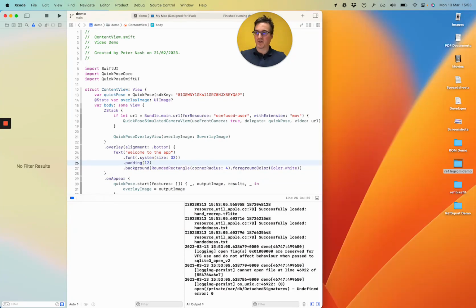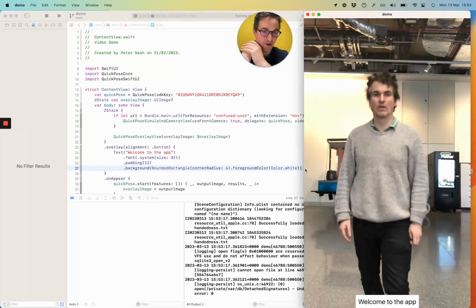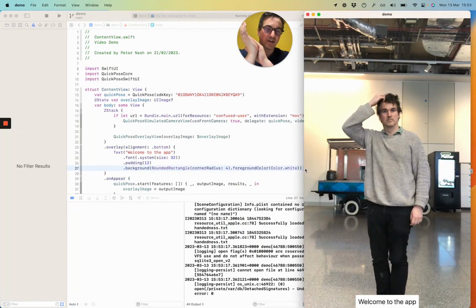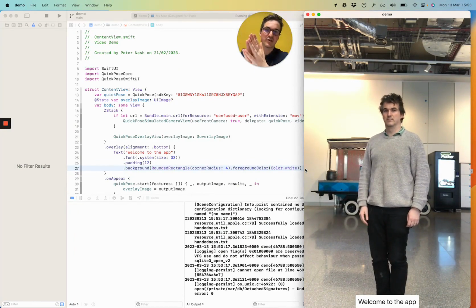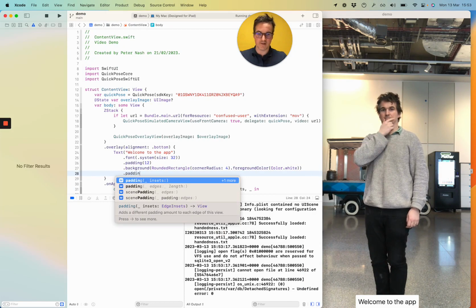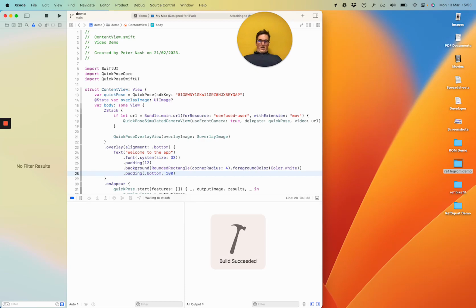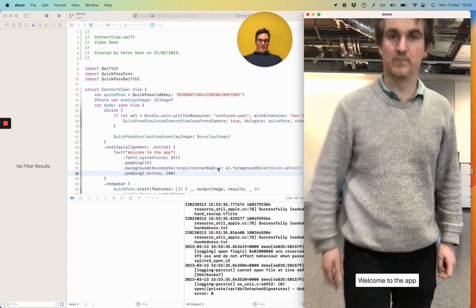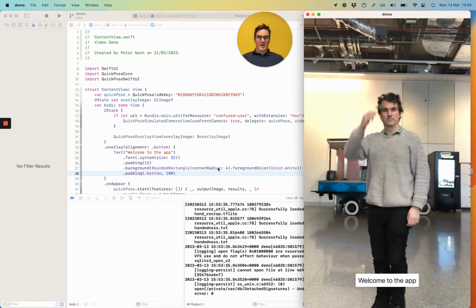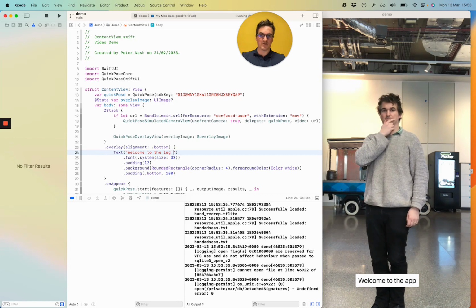I'm wary of this becoming a sort of a very detailed SwiftUI tutorial, but we need to find a bit of a balance between demonstrating the SDK features and exploring SwiftUI. So okay, I'm going to bring it up from the bottom. So padding bottom 100. So welcome to the app, great. We might want to make that a bit more meaningful. So welcome to the leg measuring app.